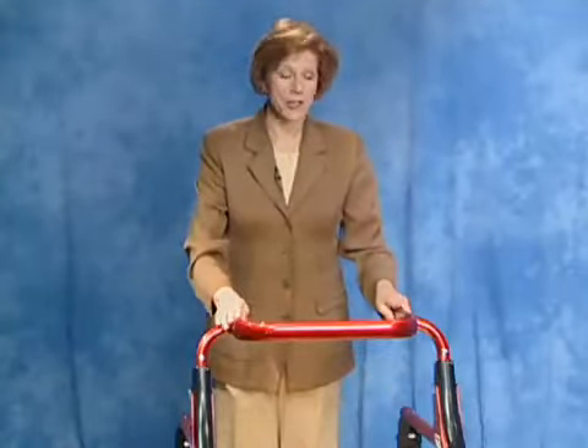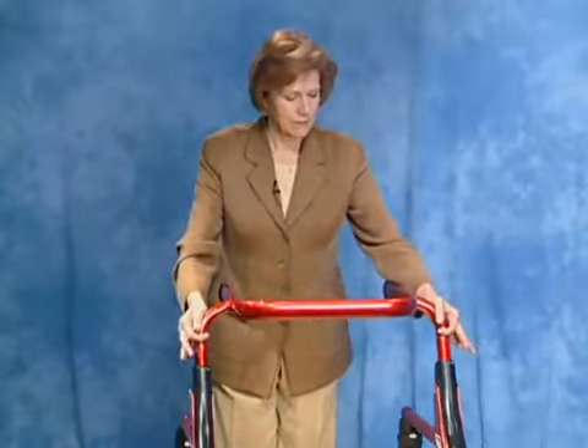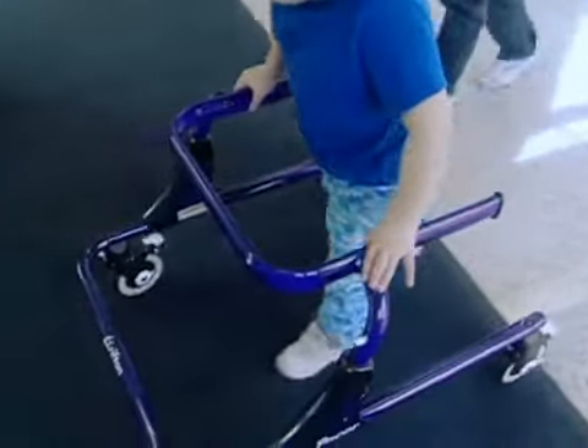The pacer comes in three sizes and the height of each frame can be adjusted with these triggers. The recommended height of the top bar is at the user's waist.